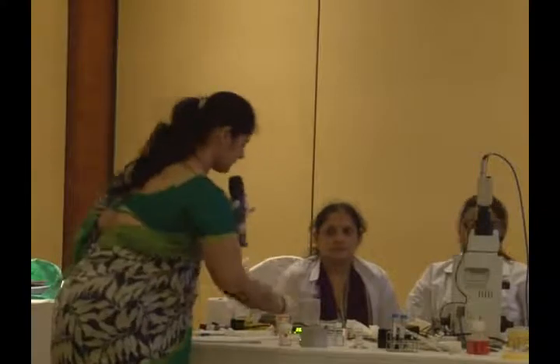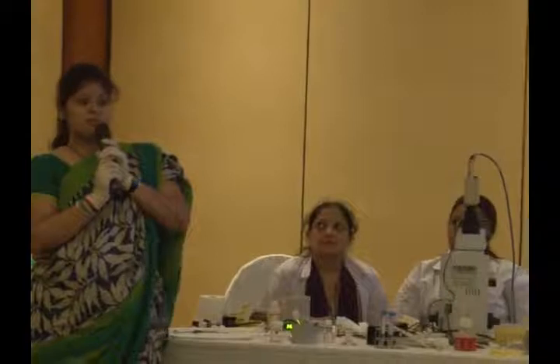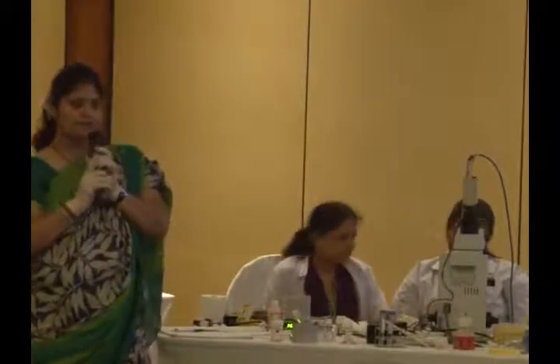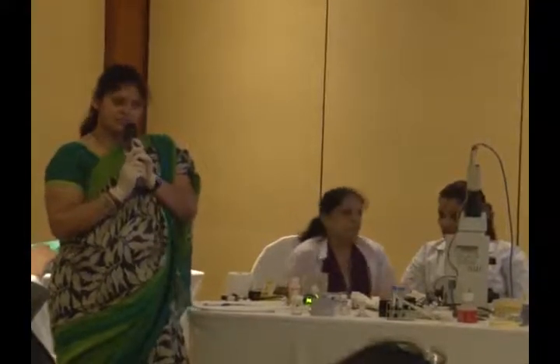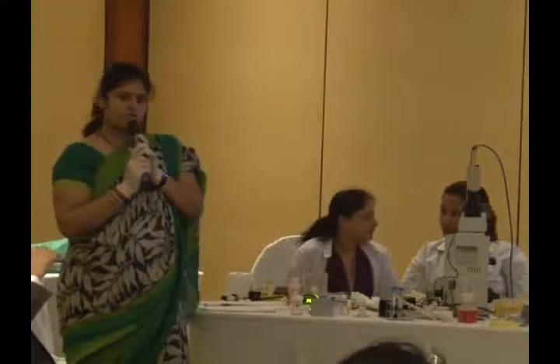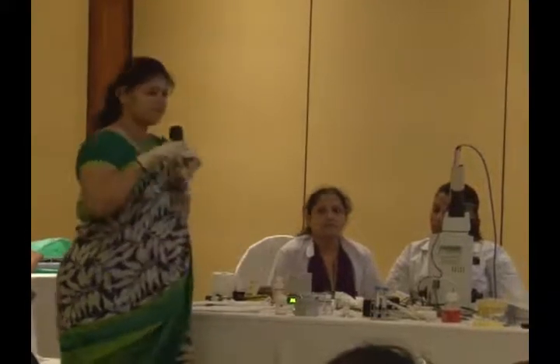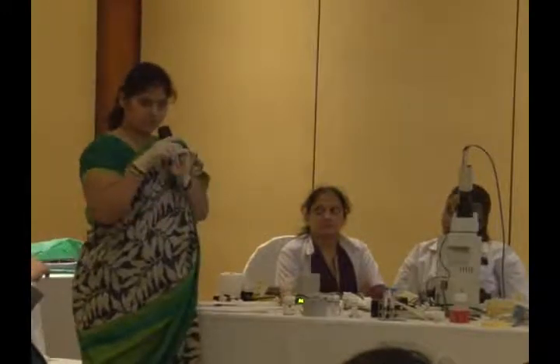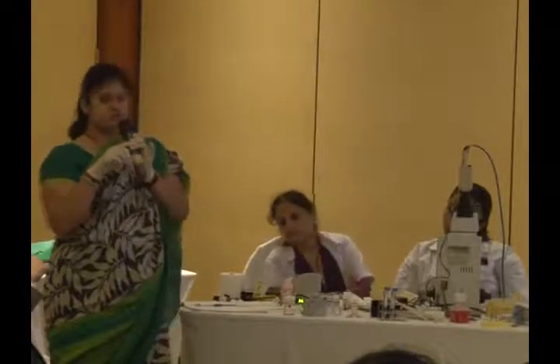See, it is not only about the temperature but about CO2 as well. If you are using a medium which has bicarbonate buffer, in that case you have to use a CO2 incubator. If the medium contains HEPES buffer, it is not CO2 dependent, so you can use a normal incubator or maybe a heating block. This medium contains HEPES buffer, so we don't require a CO2 incubator. I will keep this tube in a slant position so we have a better surface area for the movement, at 37 degrees for 45 minutes to 1 hour.